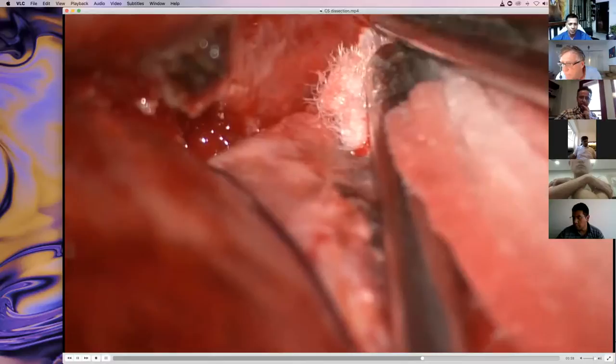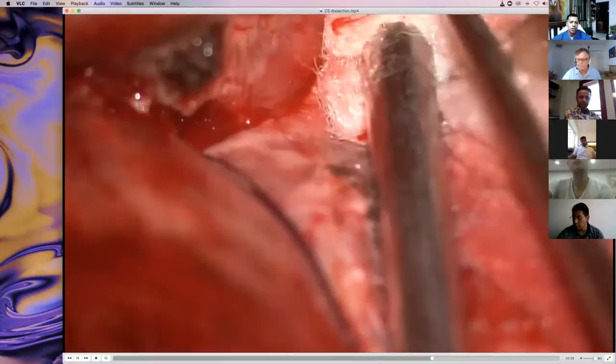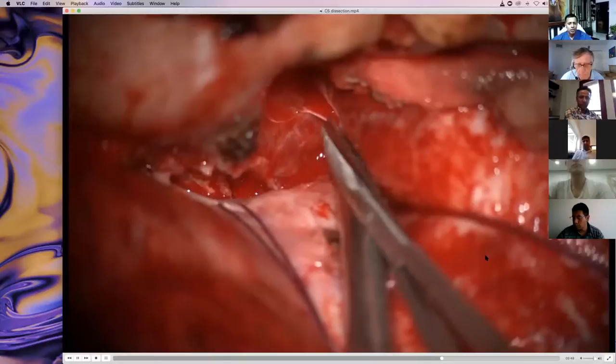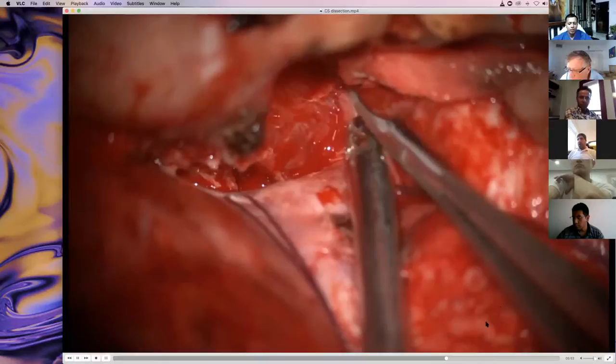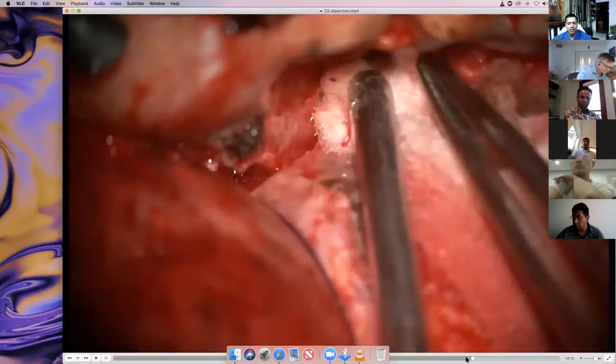You can do this for basilar tip aneurysms. You can do this for craniopharyngiomas. You can do this for any tumor in and near the mammillary bodies. Okay. You can do this for even a pontine cavernoma based anteriorly. So you can see the TCM being dissected off. And the temporal lobe pulled extradurally laterally so that the brain is opened out. Brain is really opened out.